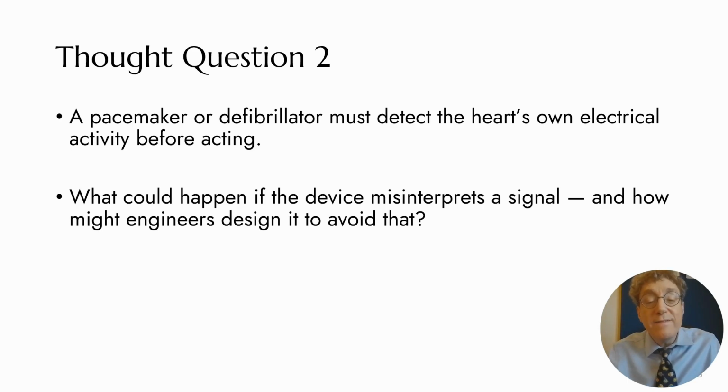disorganized. So here's thought question number 2. A pacemaker or a defibrillator must detect the heart's own electrical activity before acting. That's especially true for a defibrillator. But my question to you is, what could happen if the device misinterprets the signals in the heart that it's supposedly detecting? And how might engineers design either the pacemaker or the defibrillator to avoid these problems? Take a moment to think about that.